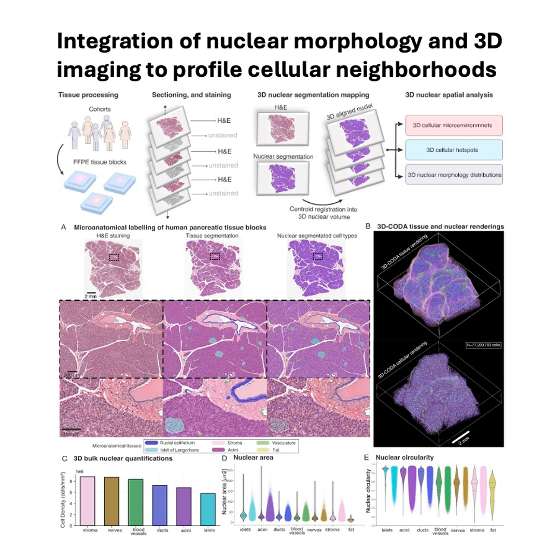Okay, so if the nucleus is telling stories through its shape, what kind of critical stories are these changes telling us about, say, disease progression? Well, they turn out to be powerful predictors of disease outcomes. For instance, studies have shown that heterogeneity, which just means the amount of variability, the differences you see, the differences in nuclear morphology within a single primary tumor can actually predict its metastatic burden. Wow, so how likely it is to spread? Exactly. Just based on looking at the variability in the nuclei, it's like a diagnostic fingerprint right there.